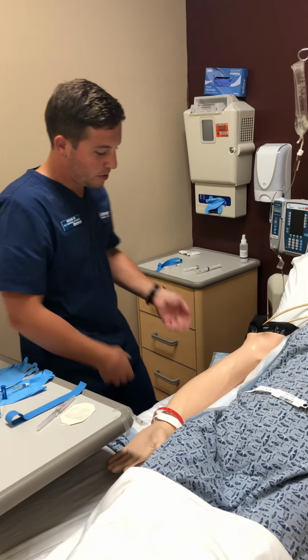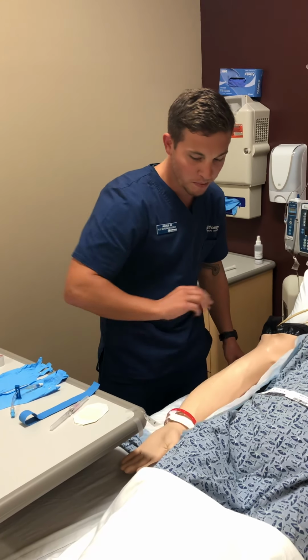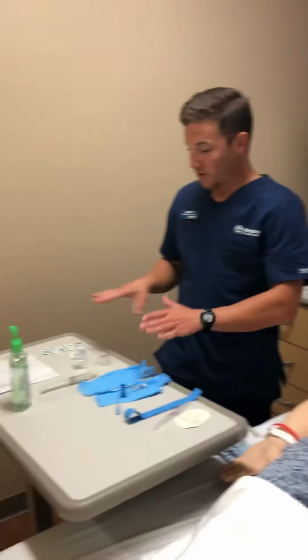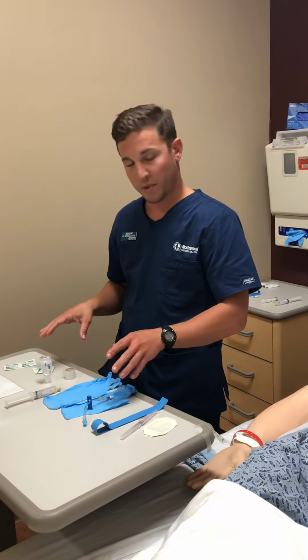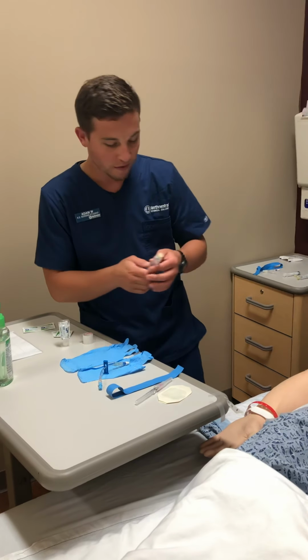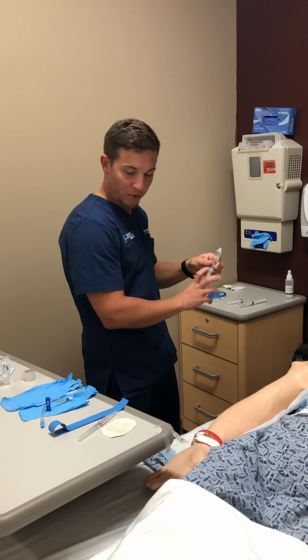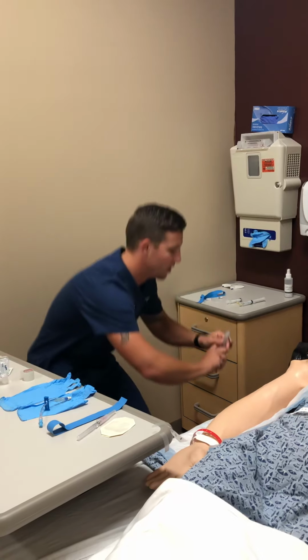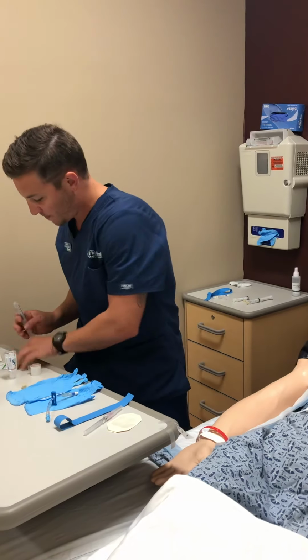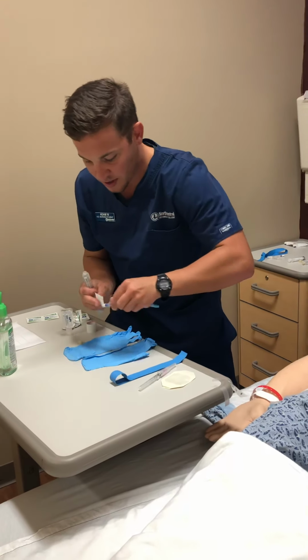So what I'm going to do next, Mary, is I put a chucks underneath here. This will collect any sort of fluids or anything so we can keep your bed nice and clean. You can also use a towel as well. Okay, so what I'm going to do next is I'm going to have my supplies here. We're just going to get things set up, all right? So I have my 10 milliliters of saline, normal saline here. We're going to use this because we're in a saline lock, and that's what we use to help prime the tubing. So I'm just going to take out any air and the garbage here. Okay, so that's good. Got some alcohol swabs here. We're going to clean the end.